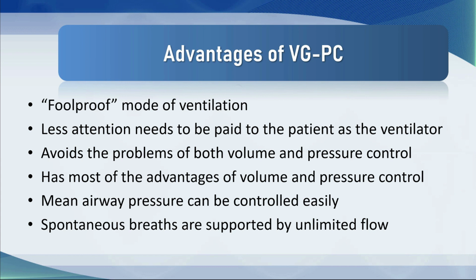It really does keep things fairly simple, and less attention needs to be paid to the patient when the patient's been moved around the bed or sat out, etc. It also avoids a lot of the pitfalls of both volume control and pressure control, while still having many of the advantages of both volume and pressure control, because mean airway pressure can be easily controlled and the spontaneous breaths are supported by unlimited flow while still giving the patient the desired tidal volume.